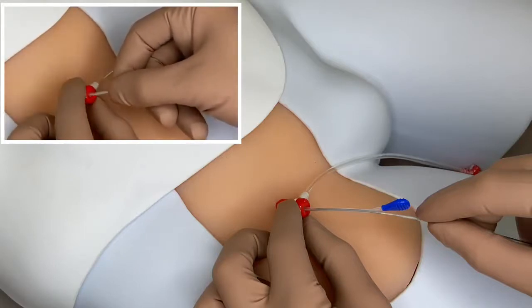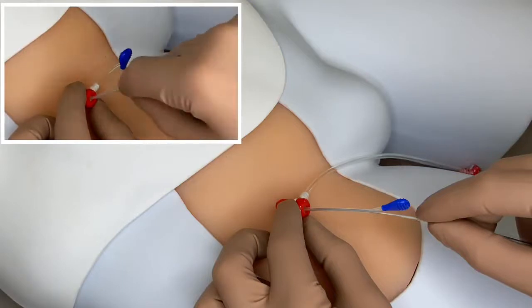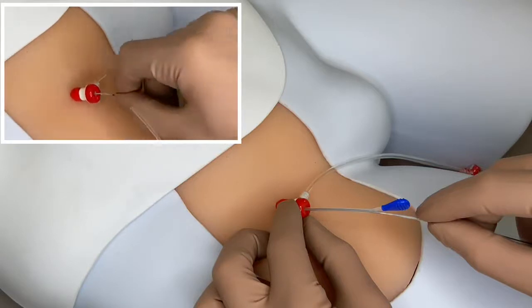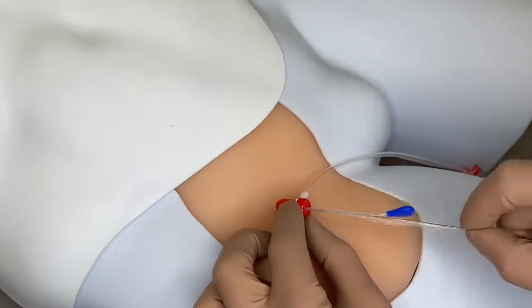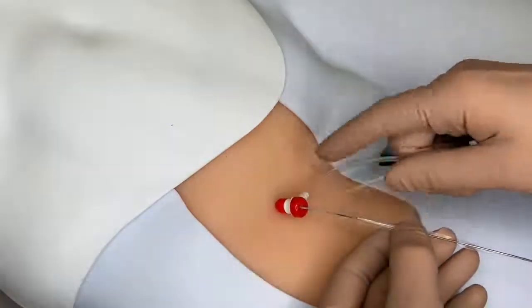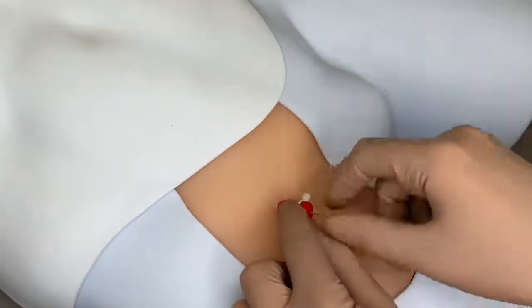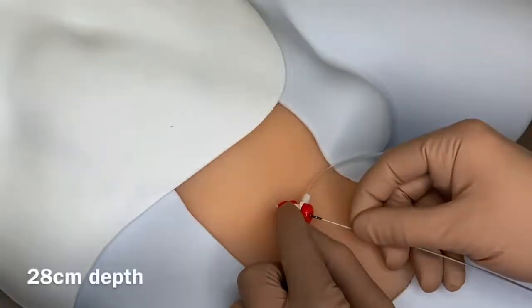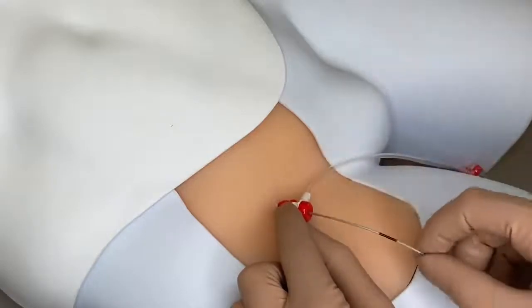To remove the straightener, hold the device at the distal RO marker and slide fingers under the blue tab. The straightener will peel away and then can be removed. Otherwise, advance the device until the balloon portion meets the blue tab and then peel away. Advance to the three black markers for approximate zone 3 deployment, and to the single black marker for approximate zone 1 deployment.